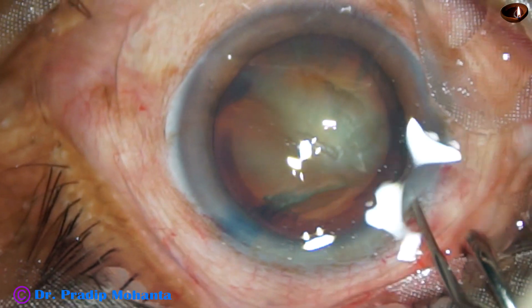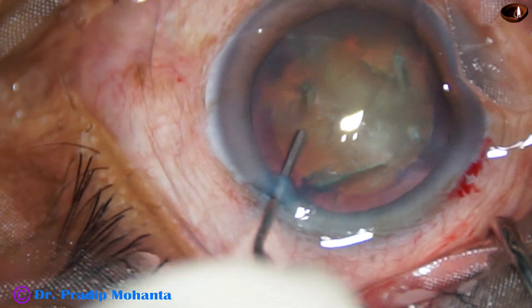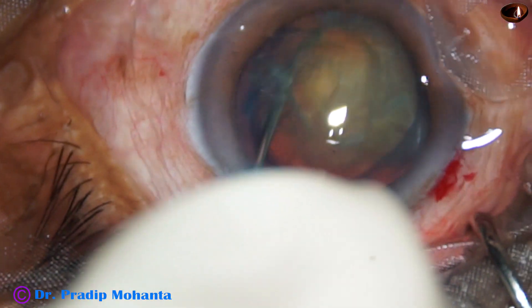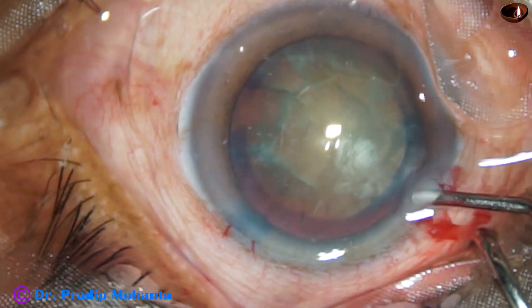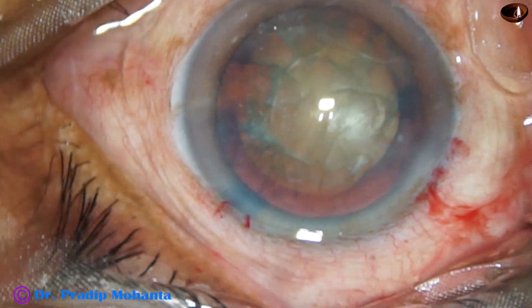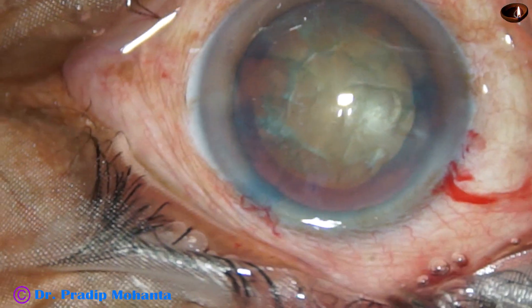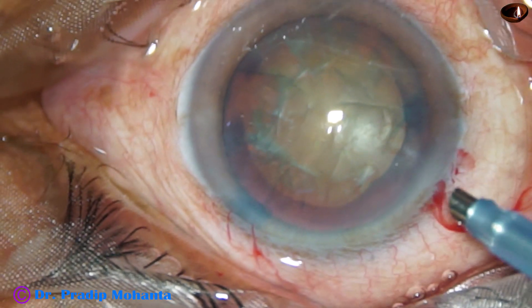Now the nucleus is tapped and mobilized. The nucleus didn't rotate nicely. Now we can rotate the nucleus after introducing the phaco handpiece.